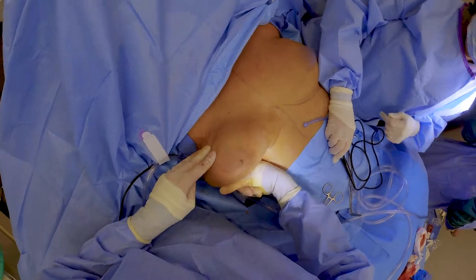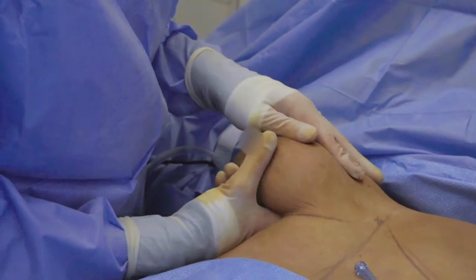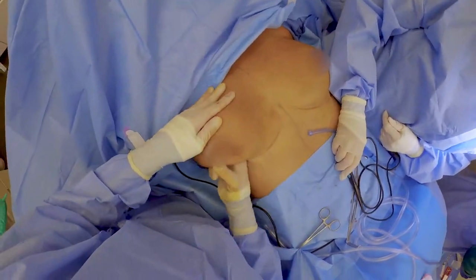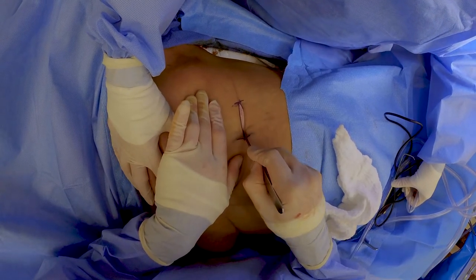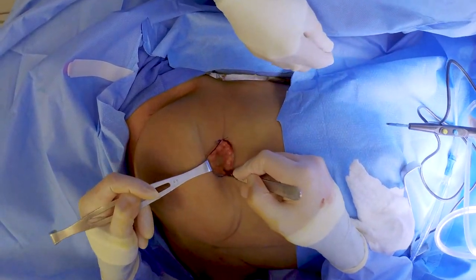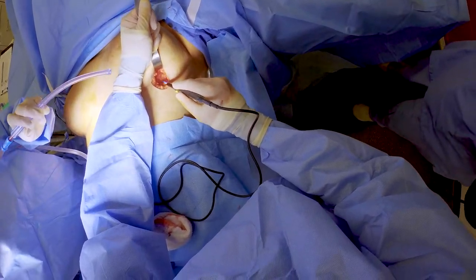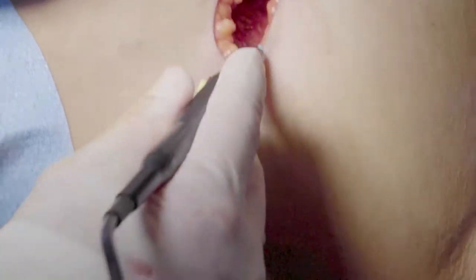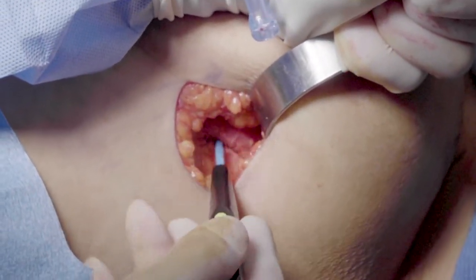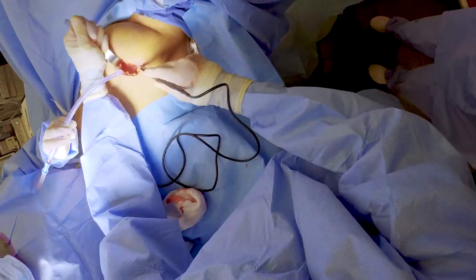The whole trick of this operation is to stay above the muscle and make a pocket above the muscle, because we're placing the implant above the muscle. I'm making space above the muscle to put the implant in. This is the muscle — I'm going on top of it. This is the back of the muscle, and this is the pec muscle, this is the edge of it. If I were going under the muscle, I'd put the implant underneath. But I'm not cutting the muscle — I'm going on top.